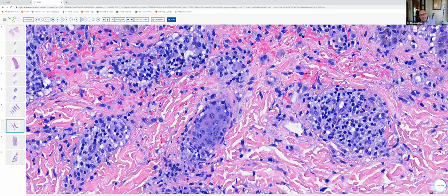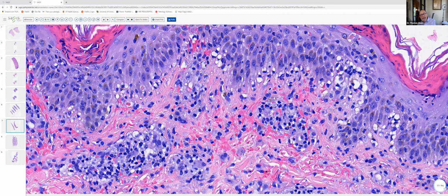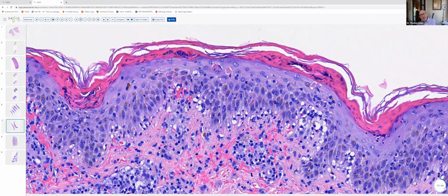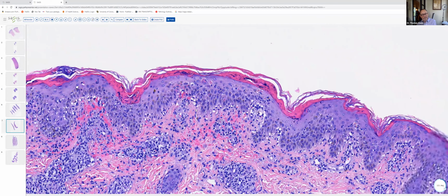Now, there are a lot of extravasated erythrocytes in the papillary dermis, and there's even some extension of these extravasated erythrocytes up into widened intercellular spaces in the epidermis. And while this is not a specific finding unique to Mucha-Habermann disease, we frequently do see it in the setting of Mucha-Habermann disease. You can see it in PR and other inflammatory conditions, which are characterized, however, by kind of an explosive onset. But this constellation of findings is extremely characteristic of PLEVA or Mucha-Habermann disease.